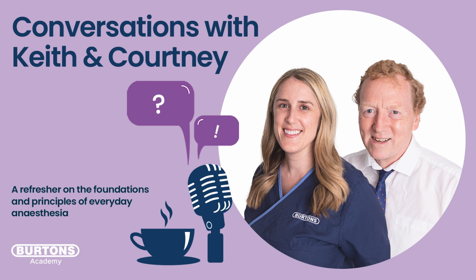No, it isn't. Even if you've got a bitch spay that's coming in, a healthy dog coming in for an elective routine procedure, you can fairly easily, if you've got a ventilator and you understand how to use it, take over their breathing quite happily. It's not a particularly difficult process.